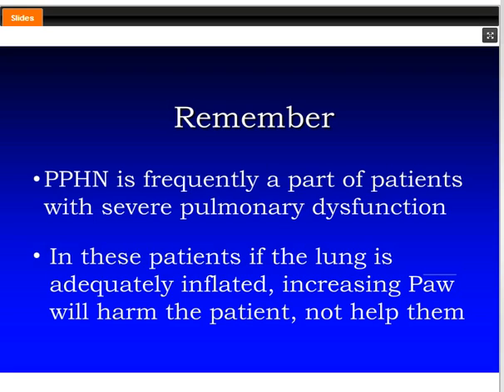And there's some evidence in some of the severe meconium patients, you can remove some of the meconium better by having a little bit longer inspiratory time. But again, it becomes very critical when using lower frequencies, or you will get into problems with air trapping.